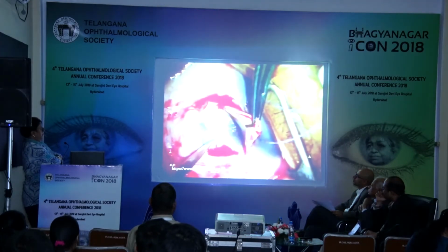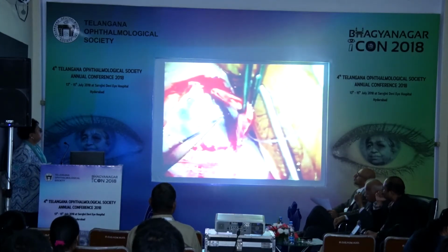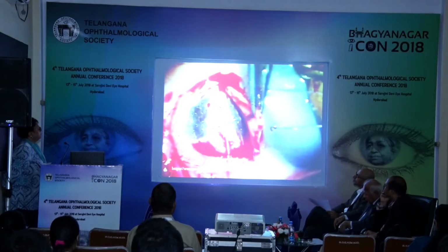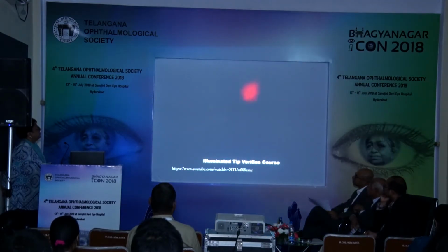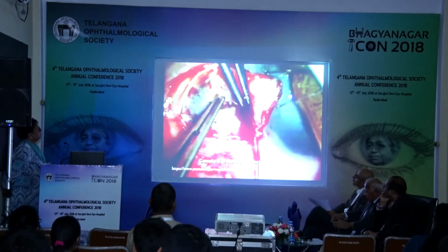Ab externo approach to trabecular meshwork in recent times has involved 360-degree catheterization of the Schlemm's canal with devices like the iTrack catheter, and this is facilitated from a single site.